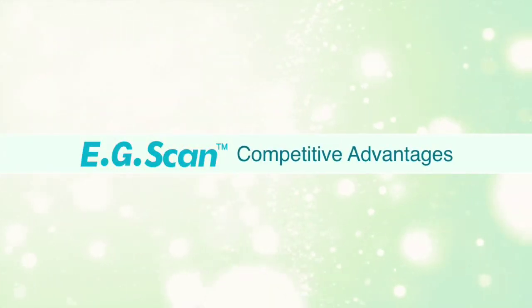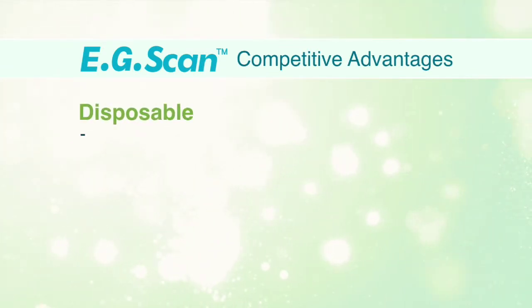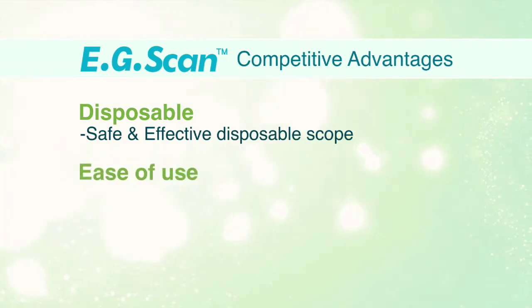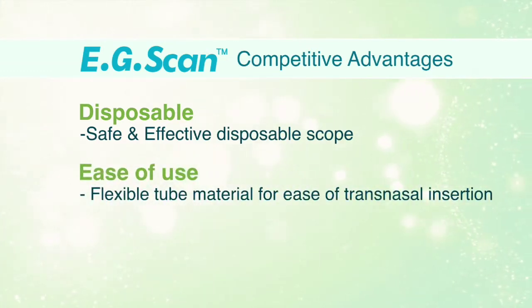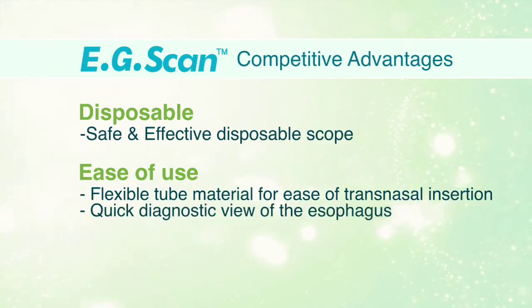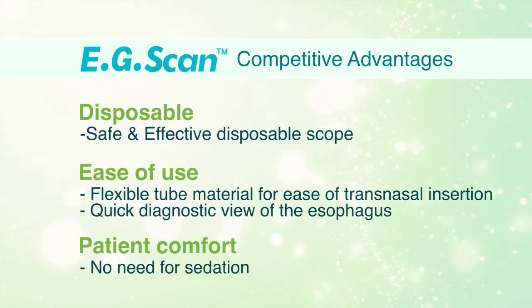EG scan competitive advantages. Disposable. Safe and effective disposable scope. Ease of use. Flexible tube material for ease of transnasal insertion. Quick diagnostic view of the esophagus. Patient comfort. No need for sedation.